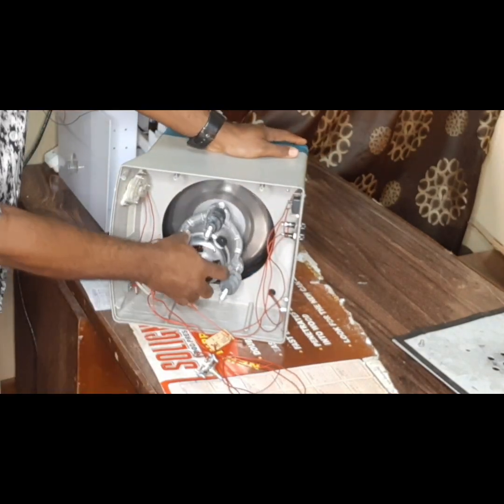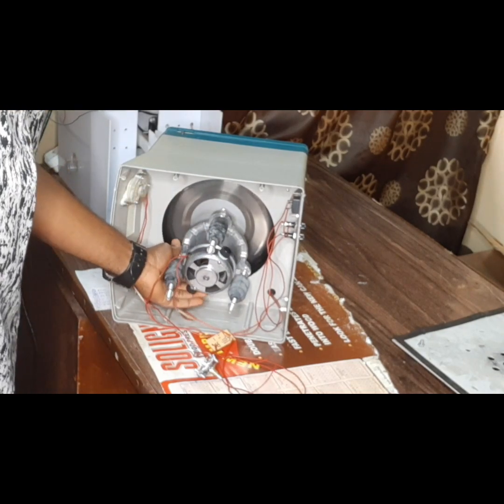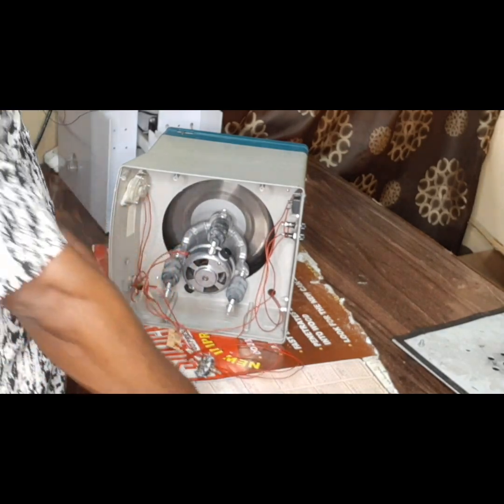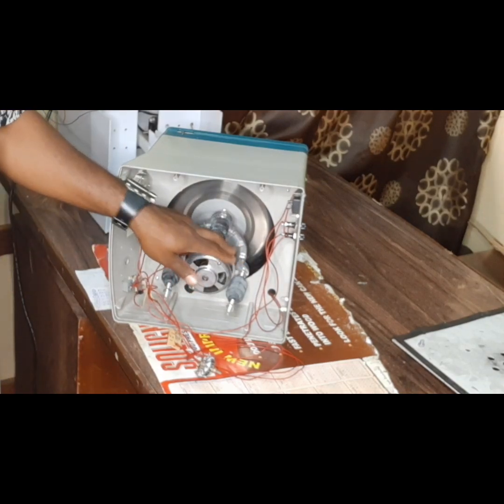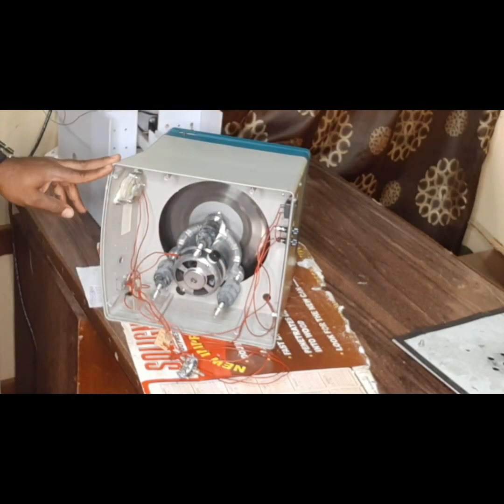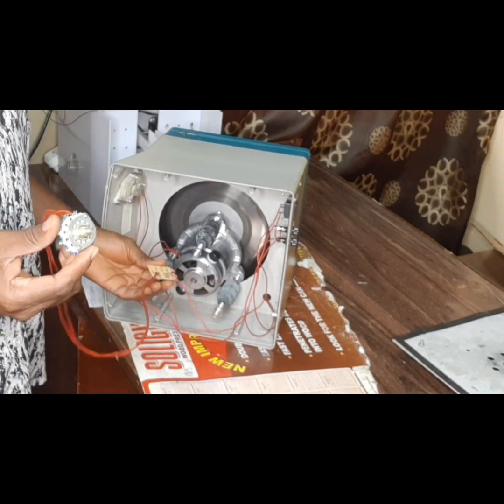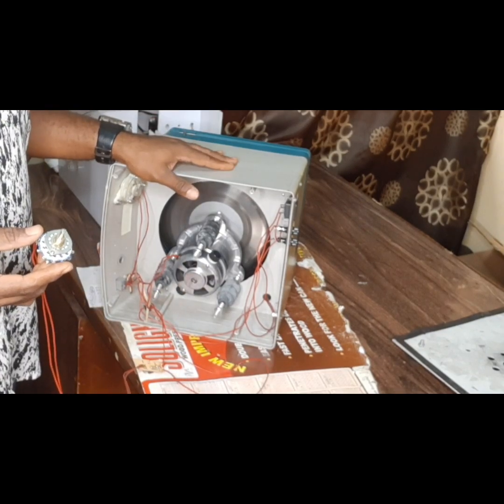Then we have been able to confirm that the AC motor, this is the high speed motor, is okay by testing and reading the resistance. We used our digital meter to confirm the resistance of this motor, and the two brushes, you can see the brushes. Here are the brushes of the motor. Both of them are okay. So the only thing that is left here is what? This is the regulator. This regulates the speed of this very motor. And if this is not okay, there is no way this will come on.